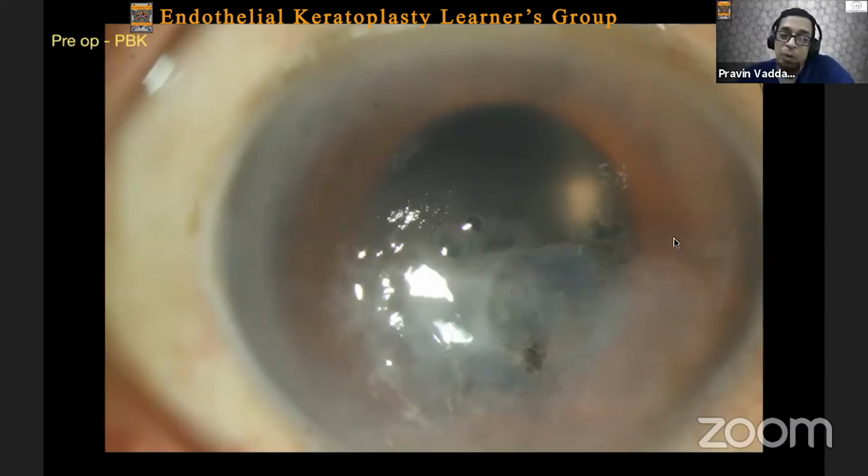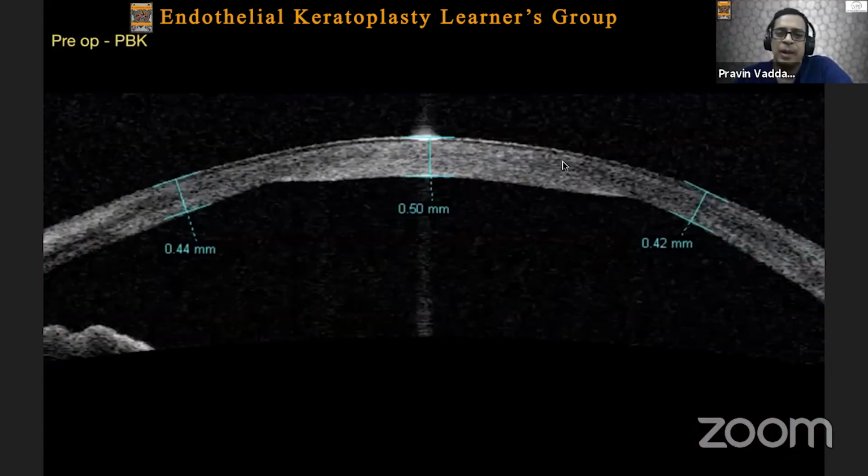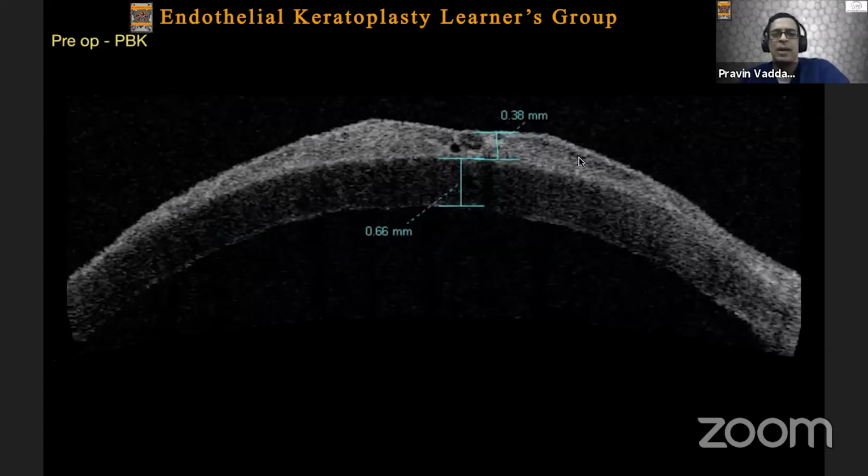You also have patients who present to you with a significant amount of subepithelial fibrosis along with bullae. These are typically patients who are several years out after the cataract surgery. They've waited, or they've been made to wait before they've had an intervention, which is a bit unfortunate. But if you look at the OCT of these patients, in the periphery you will see that there seems to be a pre-existing pathology for such severe bullae in one area. And this patient, it's not seen very well here, did have a localized central Descemet's detachment. What you will also see is a significant amount of subepithelial fibrosis, but most of the stroma is clear.